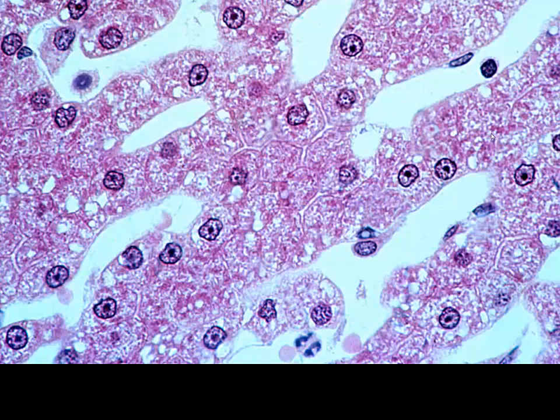Once again, we have our hepatocytes that we see with the cords of hepatocytes. We can see our lining epithelial cells, the endothelium. We have blood cells in the center, a plasma cell, a macrophage on the surface, likely another macrophage over here. But as we look in particular sections between hepatocytes, these are going to be our bile canaliculi. Bile forms in the hepatocytes, is transported into the bile canaliculi, and directed away from the central vein toward the periphery to our bile duct.